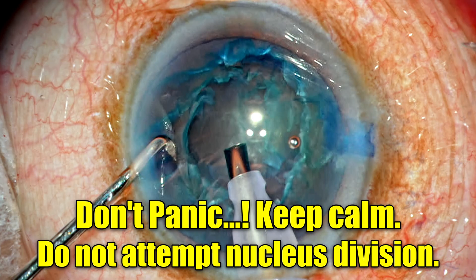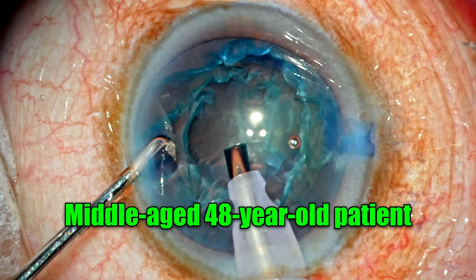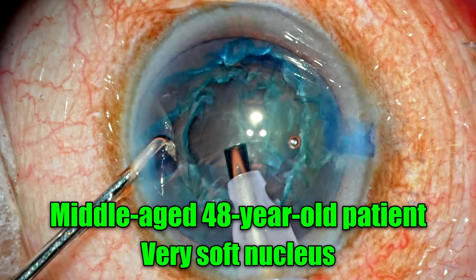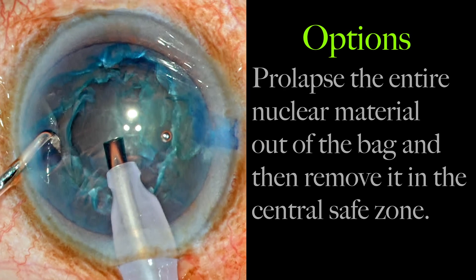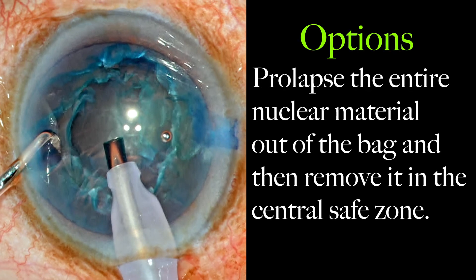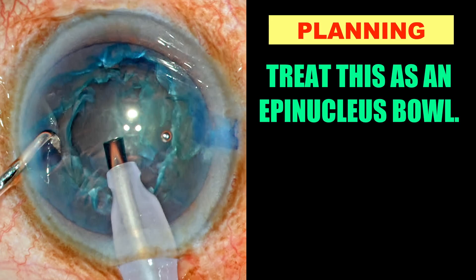There is no need to panic here. No attempt should be made to divide the nucleus now. Remember, this patient is around mid-40s, so the nucleus is softer. The only way to deal with this is to prolapse the entire nuclear material out of the bag and then emulsify in the central safe zone. Basically, treat this as an epinucleus bowl, because the nucleus is very shallow and very soft.